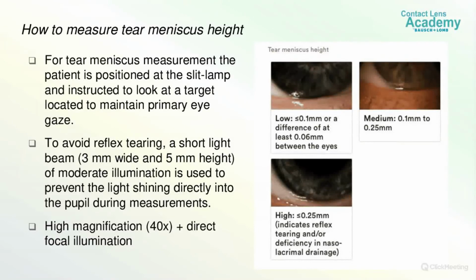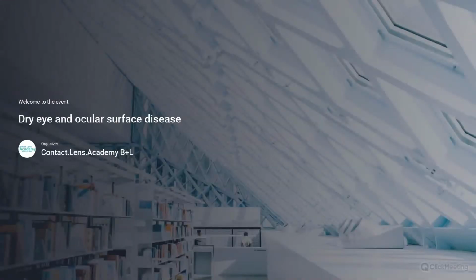Now I'm going to show you some short videos. The first shows how to apply the tear film breakup time, and the next shows how to apply corneal and conjunctival staining with the dyes I have told you about before.